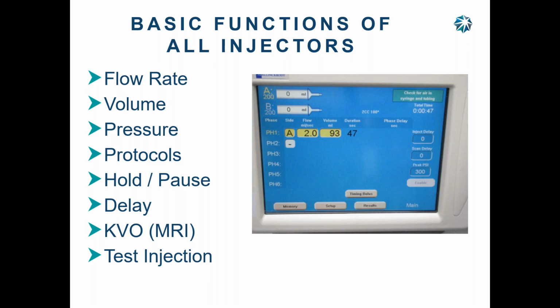Hold and pause. What's the difference between hold and pause? What does hold mean? Hold will stop the injection. It will not start again until you push a button. It requires a user intervention to push that button. It'll sit there basically all day long waiting to continue.